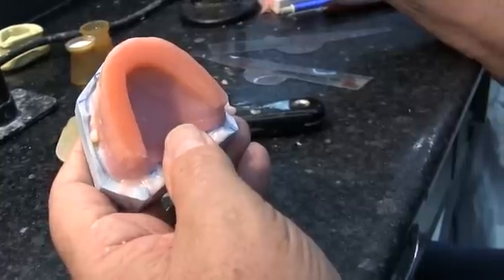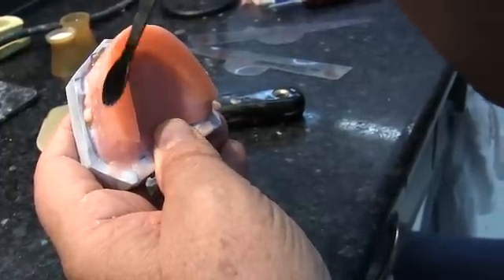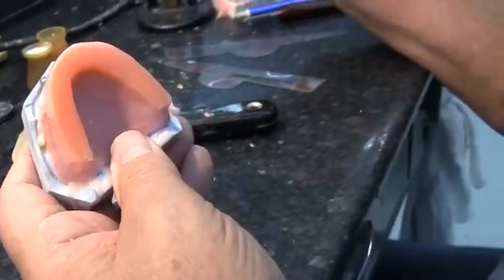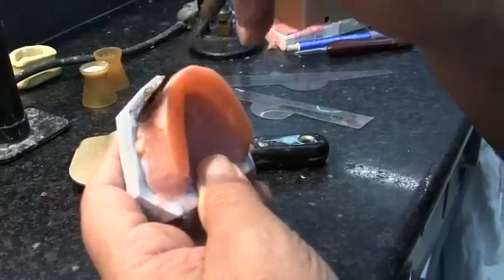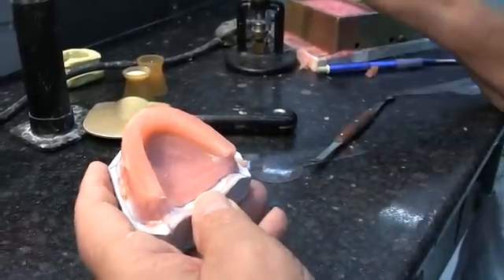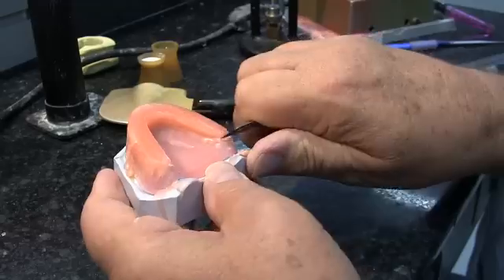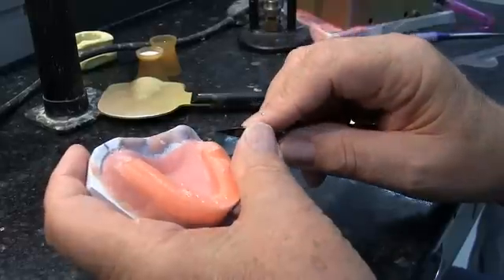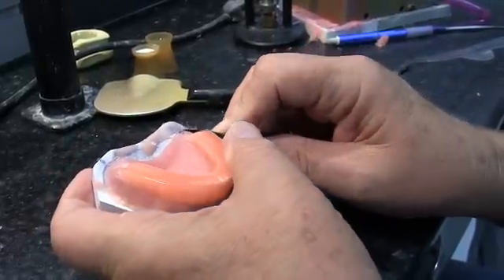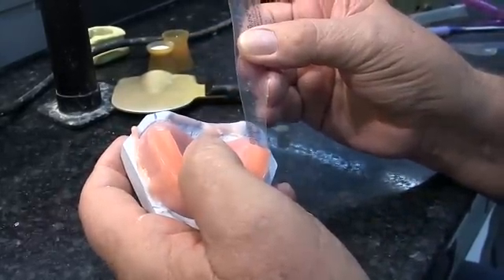We're double-checking to make sure everything looks right — verifying it's over the center of the ridges — and we're going to reshape this just slightly to make it look nice and fairly symmetrical. On the distal of these occlusion rims, we don't want them to come back too far because it will interfere in the mouth — if the wax comes back too far, it will hit the retromolar pad and the patient won't be able to close all the way. We want these to terminate 8 to 10 millimeters from the distal of the baseplate.